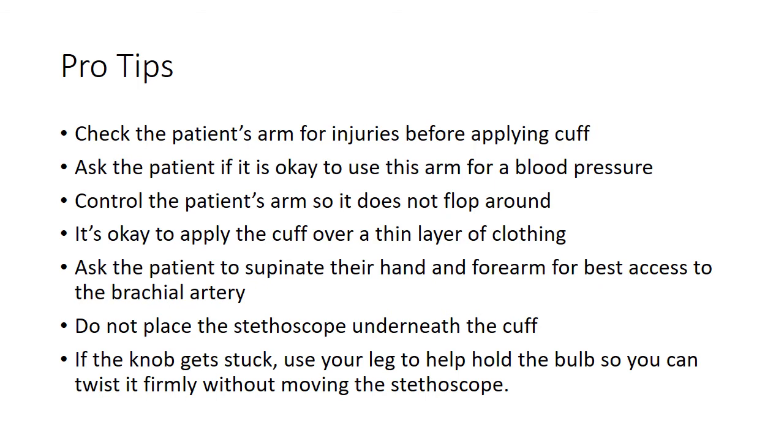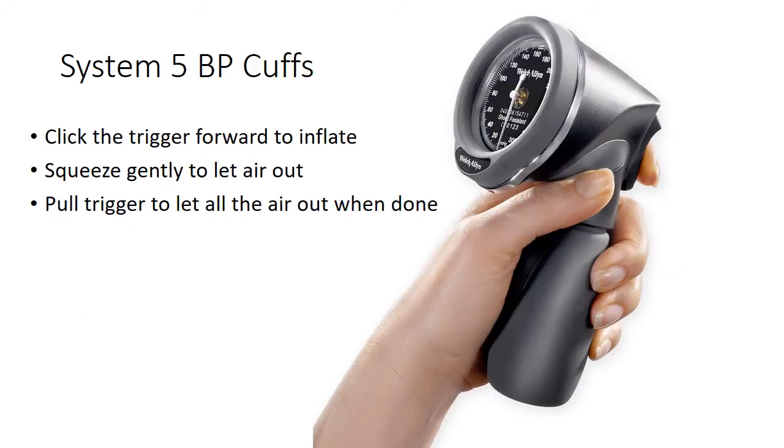Do not place the stethoscope underneath the cuff. If the knob gets stuck, you can use your leg to help hold the bulb so you can twist it firmly without moving the stethoscope. When using the System 5 blood pressure cuffs, click the trigger forward to inflate, squeeze it gently to let the air out, and pull the trigger to let all the air out when you're done.